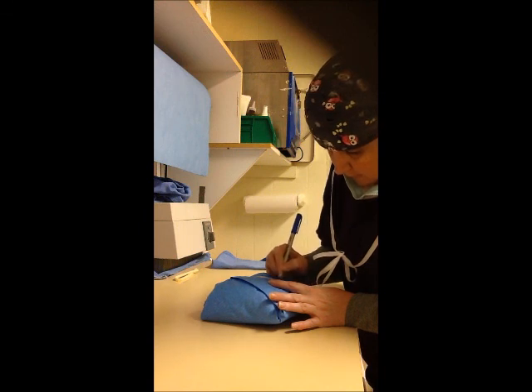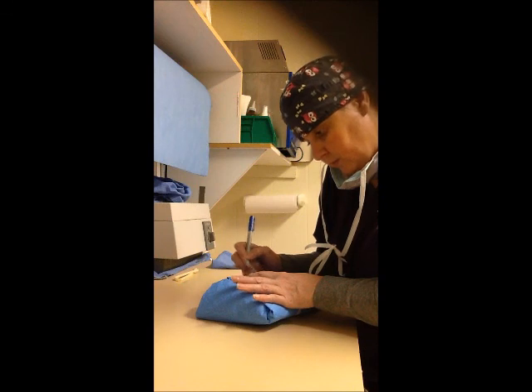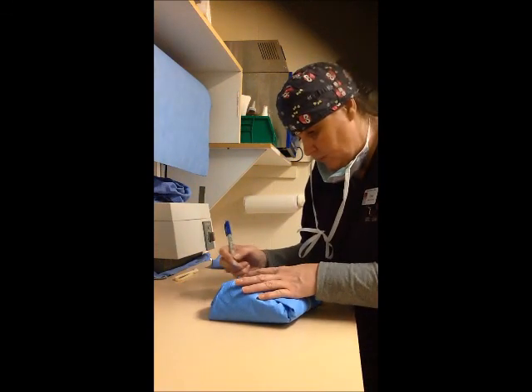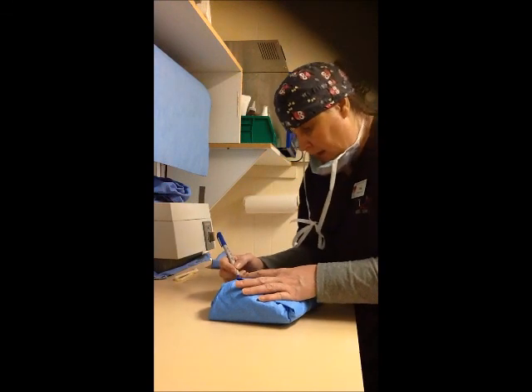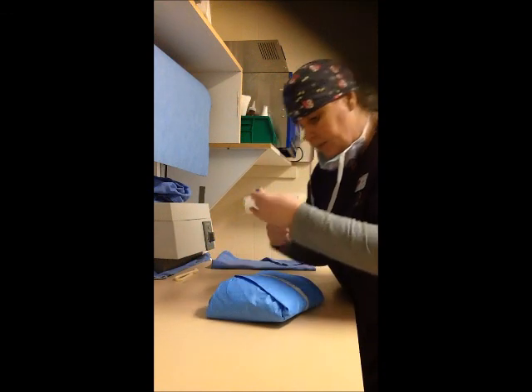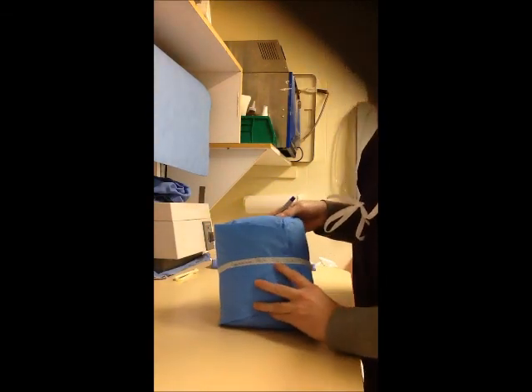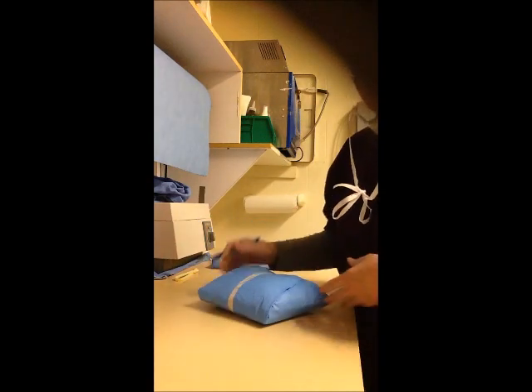Laceration pack, we then label it. We write SL because we surgically lubricated, we spray lubed the instruments. And then today's date is 1/22/18. And each surgical pack is good for 6 months, so it is good until 7/22/18. And you must initial it so you can know who did it. It's a laceration pack. We SL'd. Here's our date, today's date, and my initials.